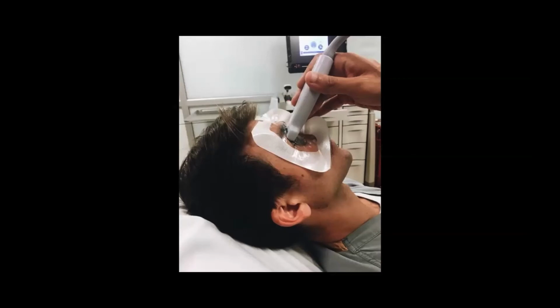And I think the answer is, you could do whatever you choose. There are no clear and hard guidelines that say you have to go one way or the other. The pro-Tegaderm side would basically say, if I put this occlusive dressing over the eye, it prevents the patient from accidentally opening their eye. It would prevent gel from getting in their eye.